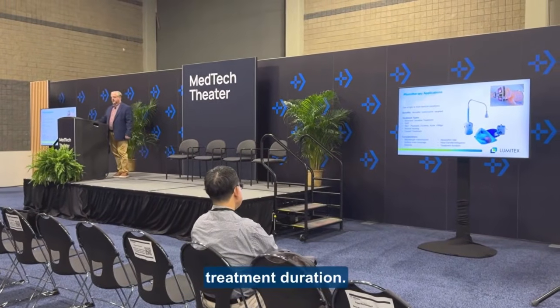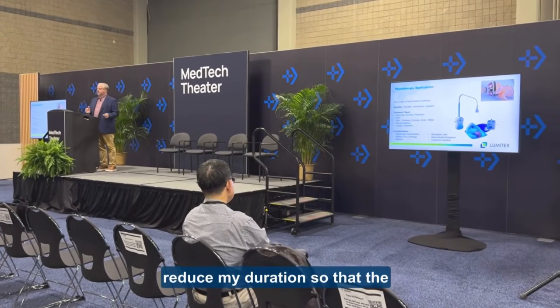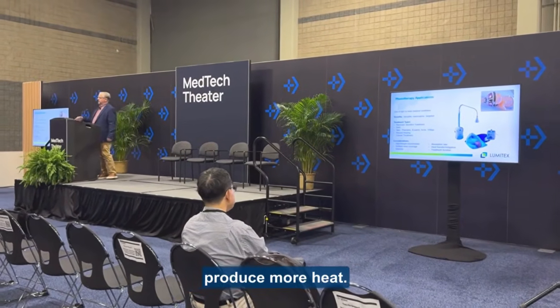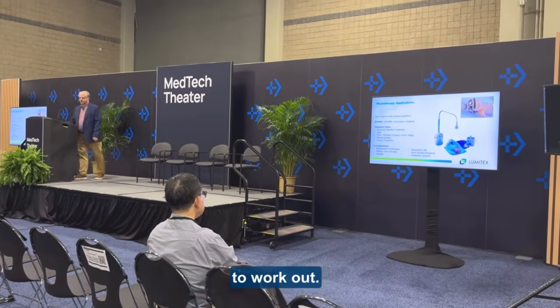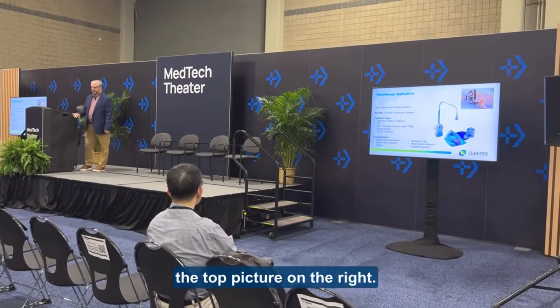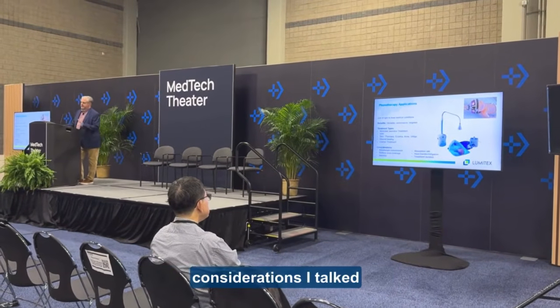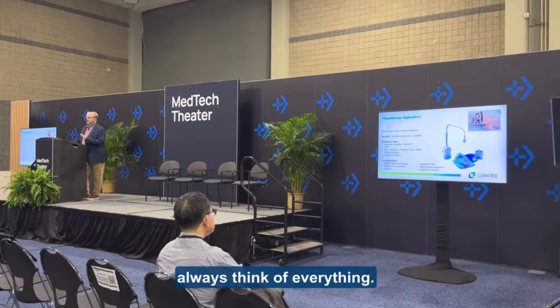And that goes along with treatment duration. As a rule of thumb, if I have a higher intensity to reduce my duration so that the patient can get out of the dosage time sooner than later, I'm probably going to produce more heat. So all three of those have to have a delicate balance to work out. Just a quick side note, the top picture on the right. That's kind of an R&D project, and it's interesting because it incorporates some of the considerations I talked about, and another one that kind of goes to show that you can't always think of everything.